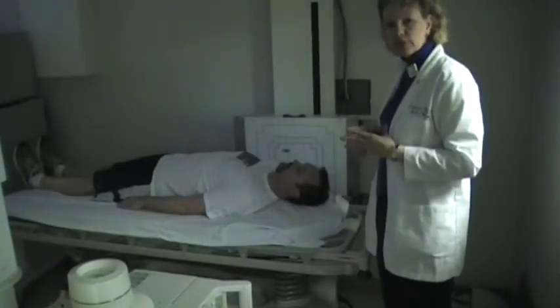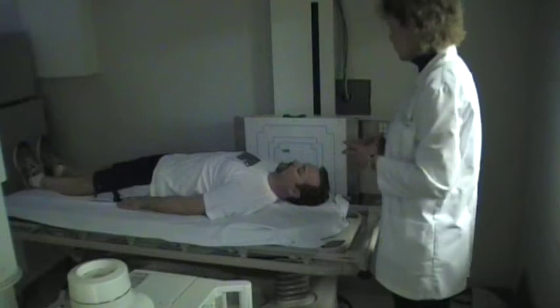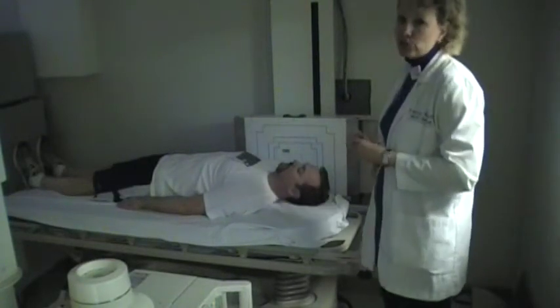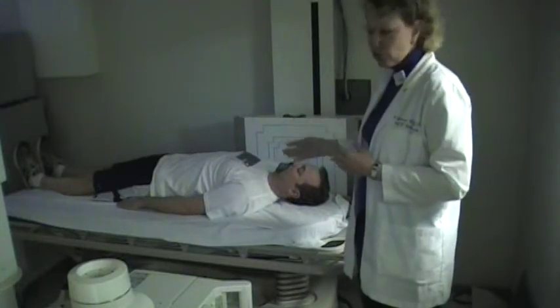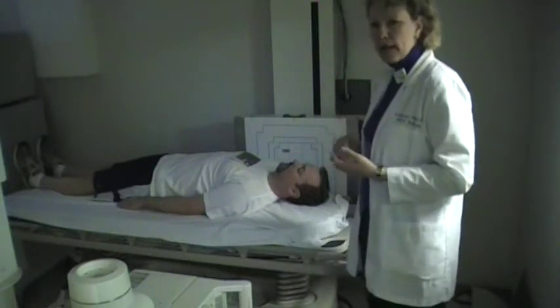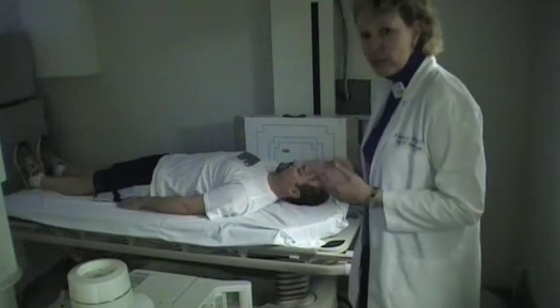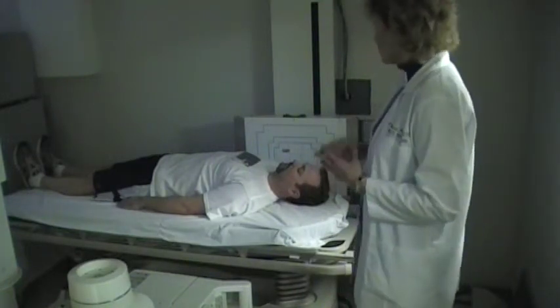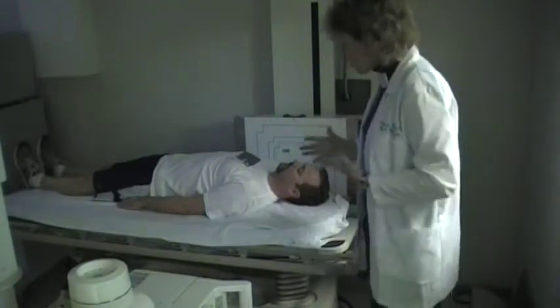We're going to be doing the cross table cervical spine, also known as the dorsal decubitus of the spine, because the patient is laying on their back and you are using the horizontal x-ray beam. This is typically used for the trauma patient when they come over from the ER — they're laying on the stretcher, usually have a neck brace on, and you're going to have to take your spine images before you do anything else.